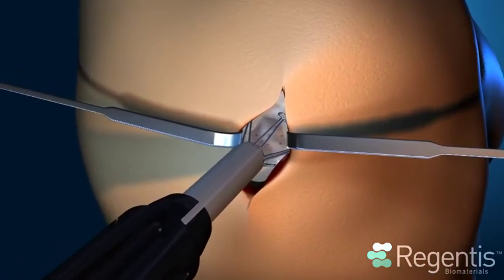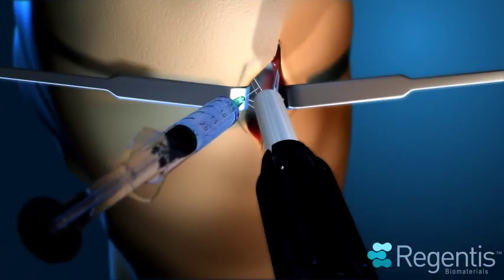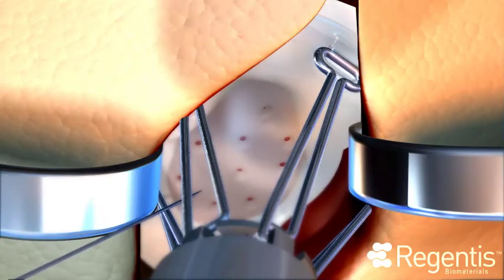After deployment, pressure is applied to seal the lesion. Gelrin-C is applied to completely fill the lesion.